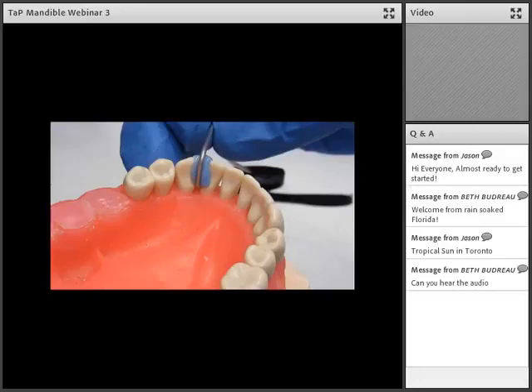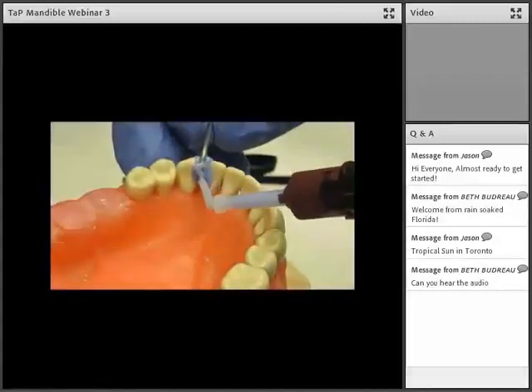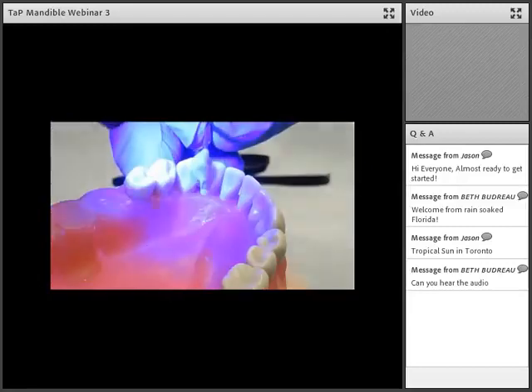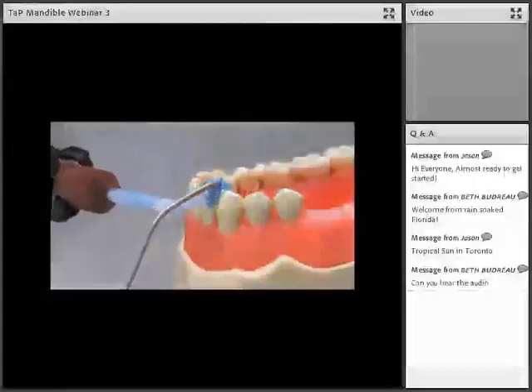I add an extra layer of composite resin onto the lingual to completely cover the part of the wire that's in contact with the tooth, and I light cure it again. Lastly, I also add some material onto the buccal aspect of the tooth to create a larger, sturdy bulk. The whole process of adjusting and connecting of the jaw tracker to the jaw takes about 5 minutes overall.